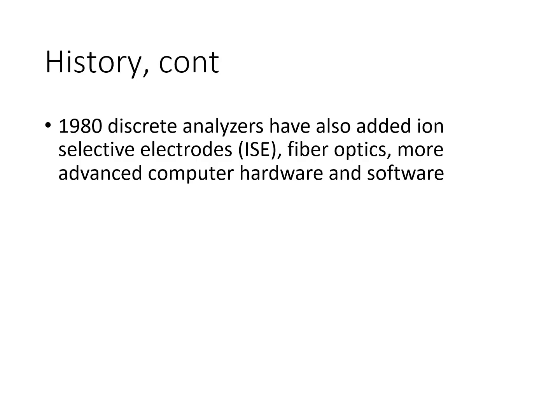Discrete analyzers in the 1980s incorporated ion selective electrodes, or ISEs, fiber optics technology, and they were more advanced computer hardware and software availability.